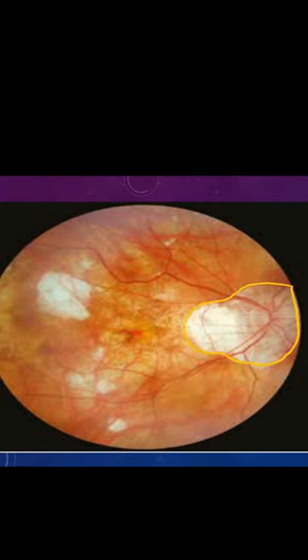As you can see, there is peripapillary atrophy. Then there are these multiple areas of focal chorio-retinal atrophy. These are these white areas. The whitish pigment over here is basically nothing but the sclera underneath.